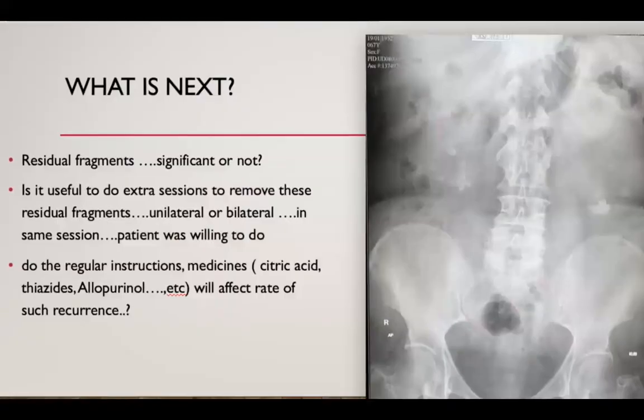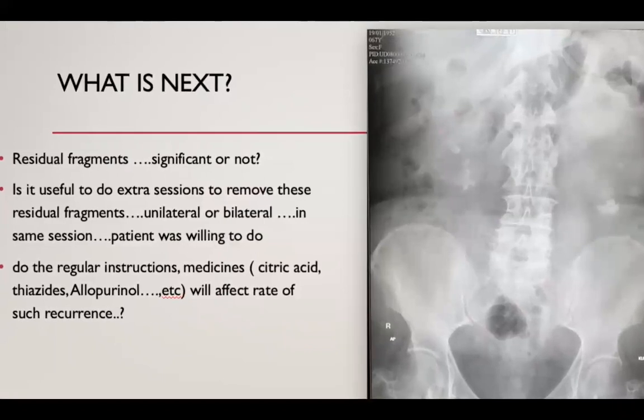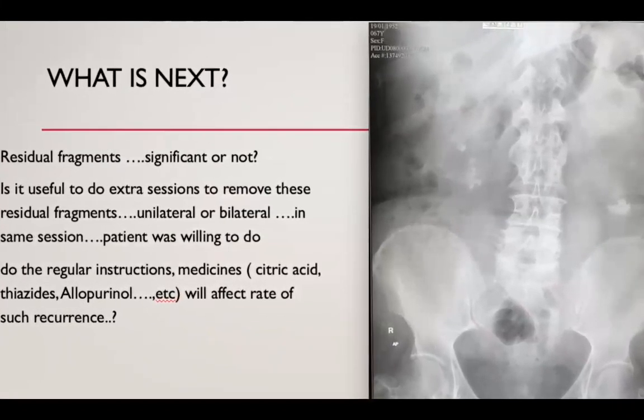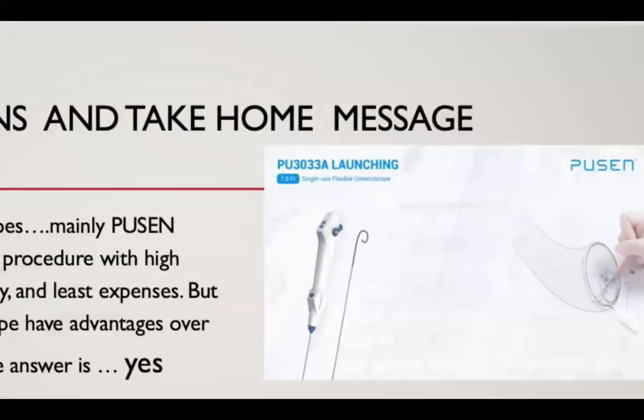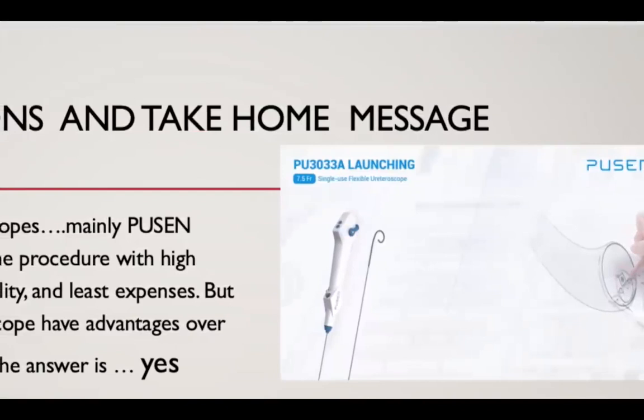Here, this is in a very difficult position. I can see the stone properly and fragment it. This is the end result — X-ray after removal of the JJ stents. These residual fragments are in a questionable area whether they are of clinical significance or not. I prefer the clinical definition of significance for these fragments.